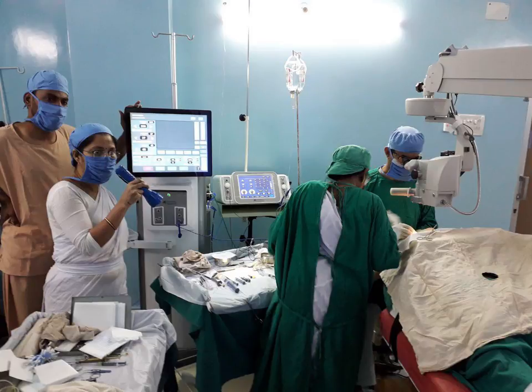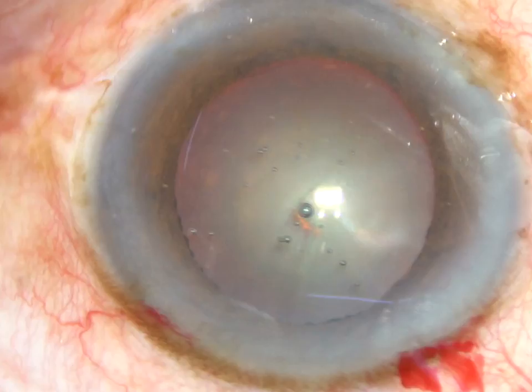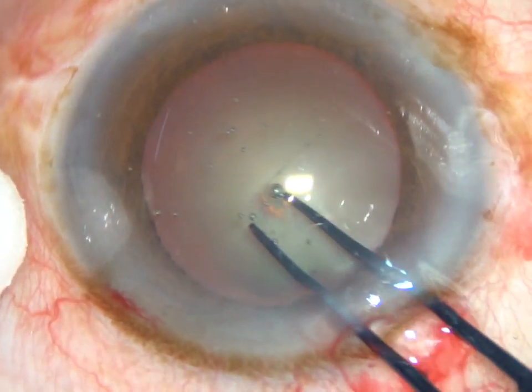Friends, welcome to my workplace at Ranaghat, West Bengal, India. Today I'm going to use Leo Phaco machine of Appa Sami Associates in a routine case. This is a cataract with grade 3 nuclear sclerosis.